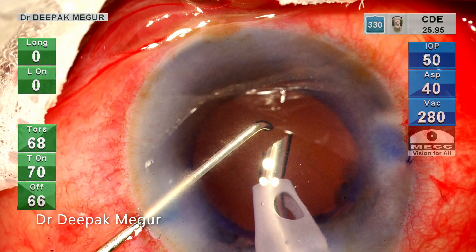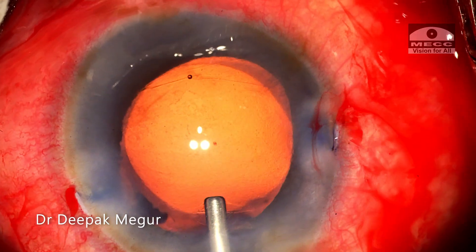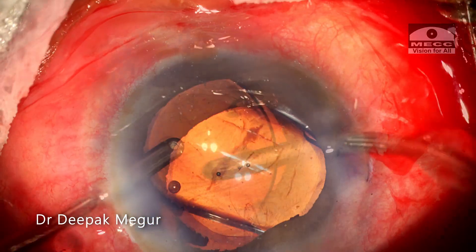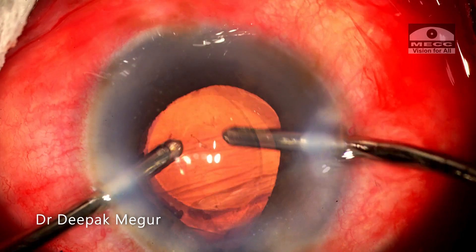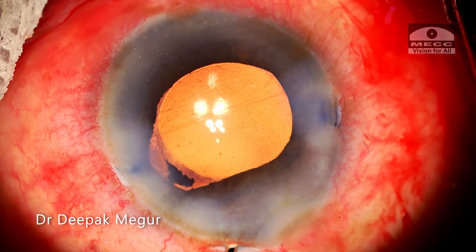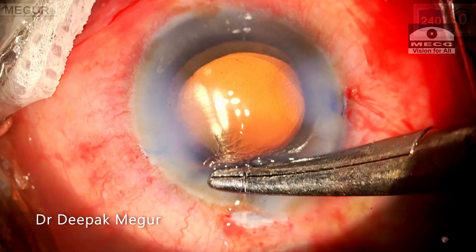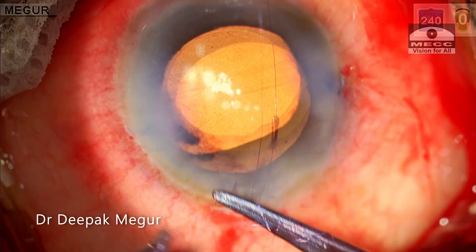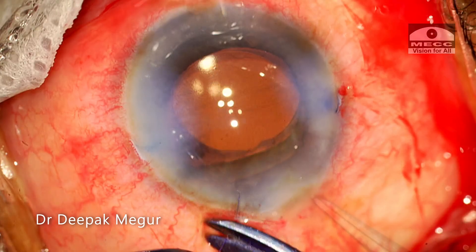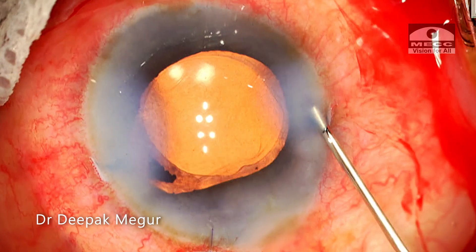The emulsification is done. The residual cortex is aspirated out. The intraocular lens is implanted into the bag. OVD is removed, but the flabby iris is still trying to come out through the main incision. I go back and decide to suture the main incision with a single radial 10-0 Vicryl suture. The side ports are hydrated. The chamber is well formed. The eye is soft. The case is done.